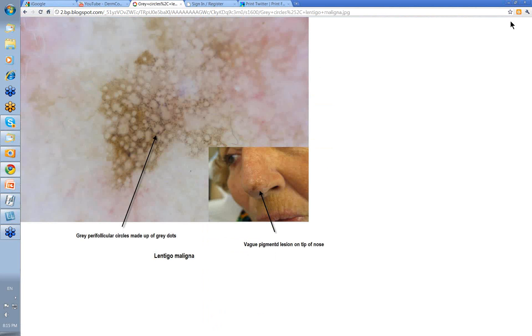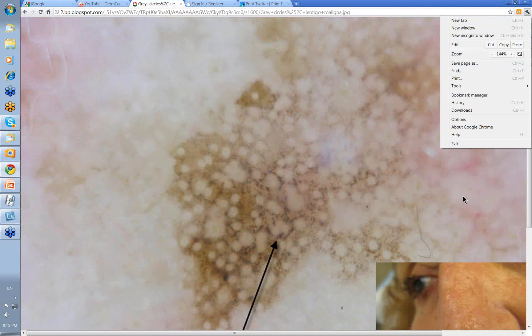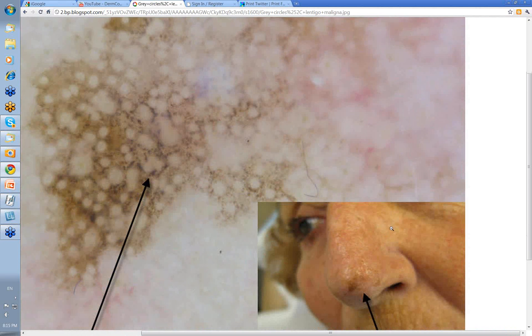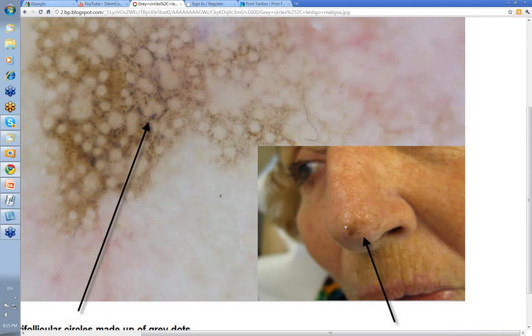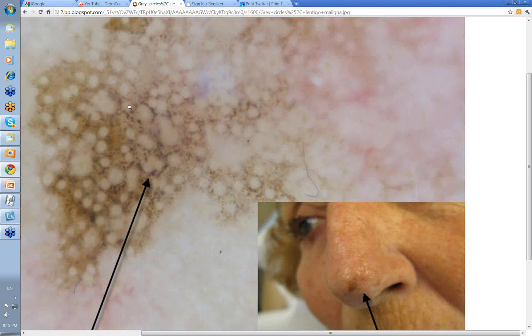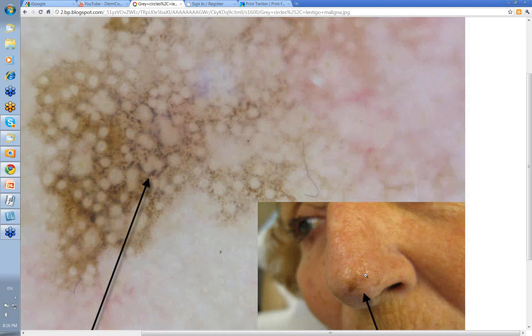This one is a little bit more obvious. Here you can see the pigmented area extending over a fair area. With the dermatoscope, you see the gray pigmentation around the follicle openings, sometimes forming gray circles. When you see these gray circles, there are four things to consider: lentigo maligna is top of the list, then lichen planus-like keratosis, pigmented solar keratosis, and pigmented intraepidermal carcinoma. Pigmented solar keratosis is usually a bit rough on the surface whereas lentigo maligna isn't. But you can't be certain on dermoscopy alone — you need a shave biopsy to make your diagnosis before deciding on treatment.